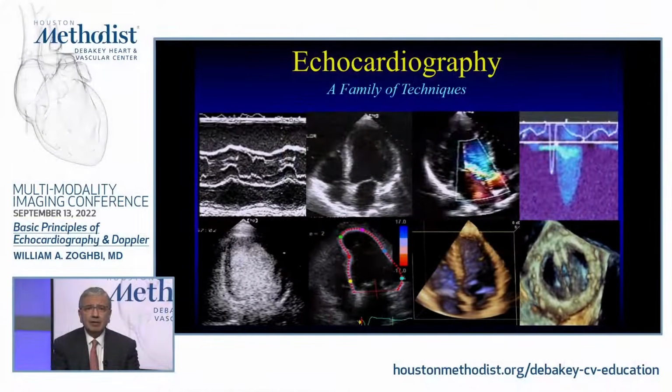The reason is, it really is very important for you as an interpreter or performer of any of these imaging modalities to understand the physics behind it, how images are constructed, because it can also give you a stronger basis for interpretation, particularly when there are some artifacts or things that may not be real from an imaging point of view, because of reverberations or other things due to the principles of echocardiography and Doppler. So what I'd like to do in the next 50 minutes or so is to go over the principles of echocardiography and Doppler.